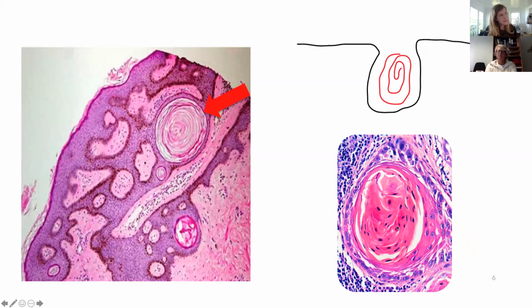It's a little bit different than our pseudo-horn cyst, where we see that we've got normal epithelium, we've got this purple granular cell layer. That's the keratohyalin granules that make normal appearing keratin. And here you can see there's no keratohyalin granules, and we've got abnormal keratin. In fact, there's retained nuclei, so it's like parakeratotic.